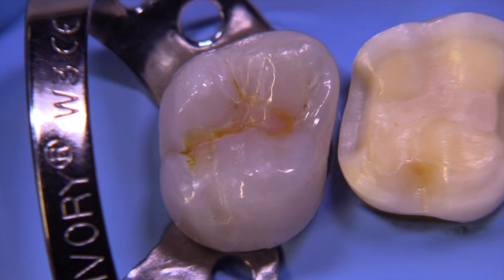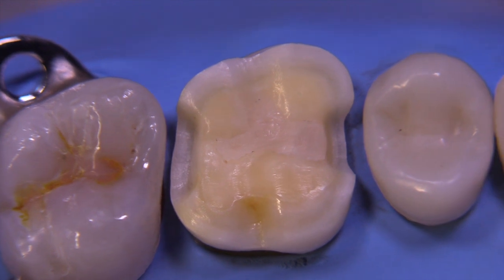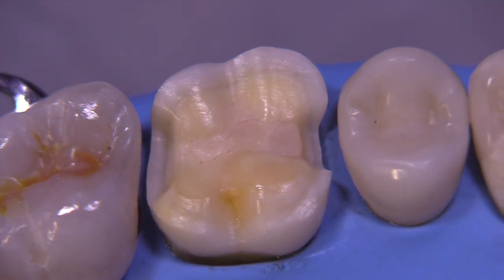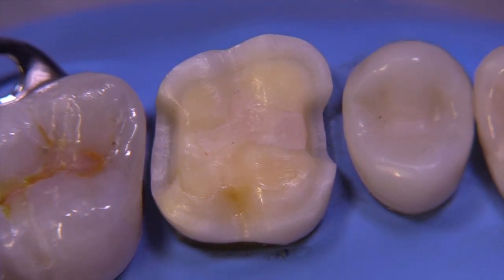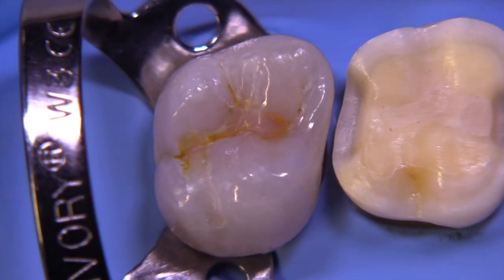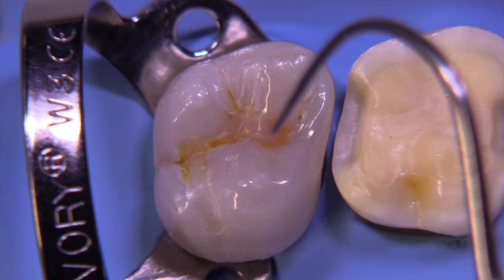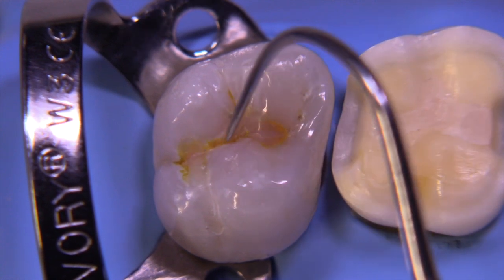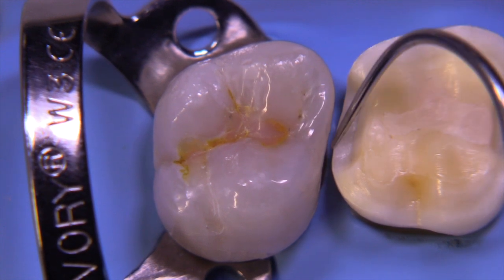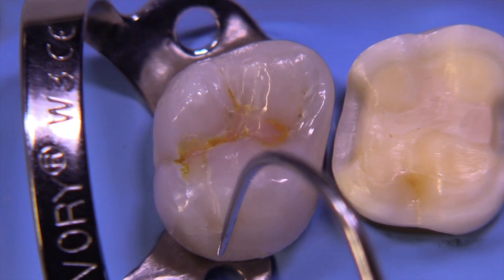Let's take a look at this starting situation. I've put some caries on the mesial of the second molar. The first molar is finished — the preparation is good to go, and typically you would have done both at the same time, but I broke them into two parts. We have plenty of caries on the occlusal and also caries extending onto the lingual. That mesial lingual cusp was significantly undermined, which resulted in a wider outline form.